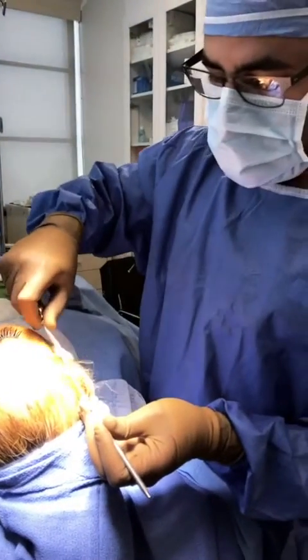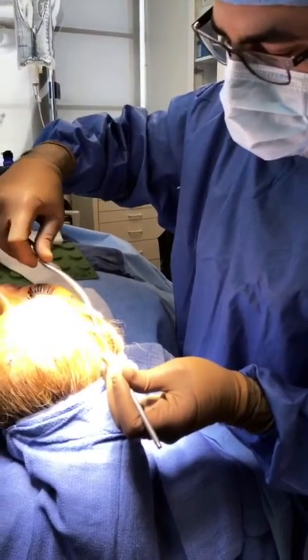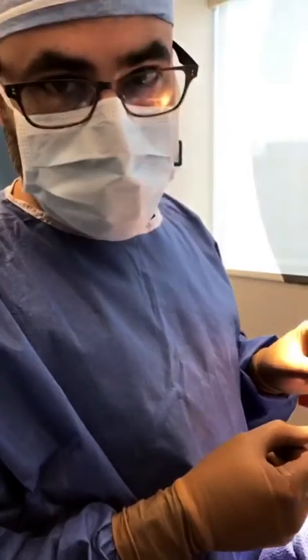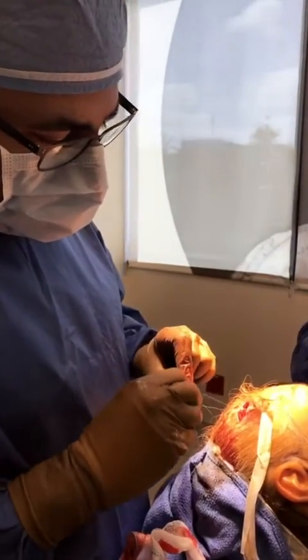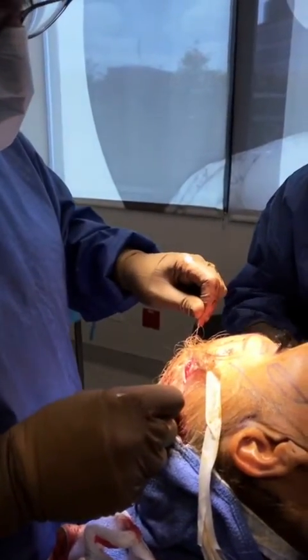So right now we're doing an endoscopic brow lift through little incisions in the hairline. This kind of surgery just restores where your brow used to be. It does not make anybody look fake, weird, or surprised. Alright, so right now we're finishing the brow lift. The way that we're suspending the brow up is with this PDS stitch. It goes through little tunnels that I made into the bone to suspend to.